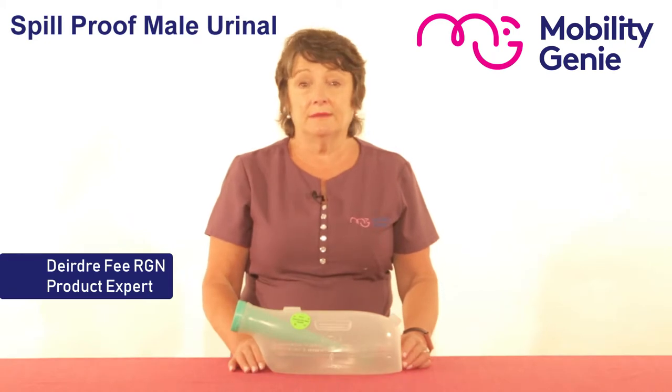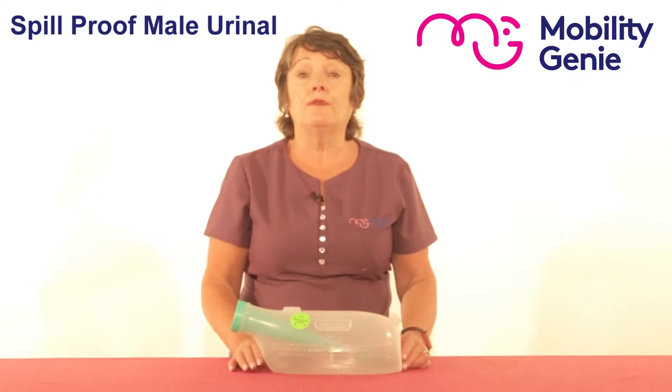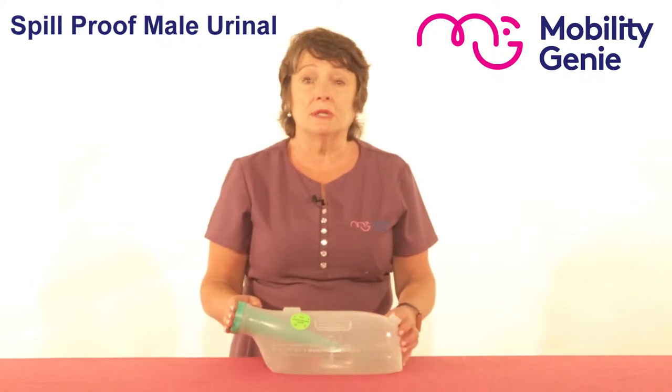Deirdre from Mobility Genie. At Mobility Genie we often get referrals from an occupational therapist for a spill-proof male urinal. This is a spill-proof male urinal that, no matter what position it is placed in, the contents will not escape.